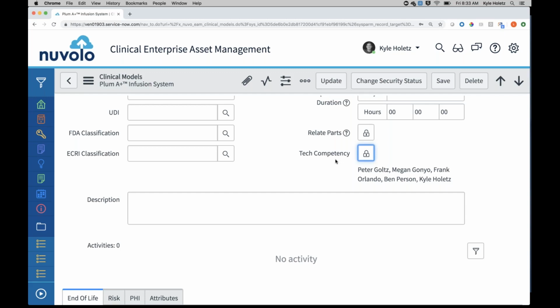And all 5 of those have to be approved, right? That's exactly right. Those 5, with that workflow process we talked about, still have to be reviewed. So if, for example, they accidentally did go out to an OEM or a service provider to perform that work, we could flag those and not include them as part of that certification process. The goal is that once they've done 5 correctives themselves, and there's been an audit and approval by the supervisor, then they get added to this model of device as competent in that particular model. And that's what we're doing daily.